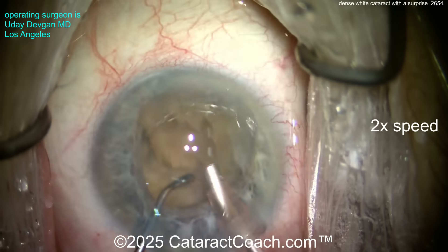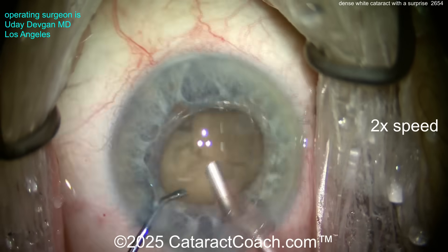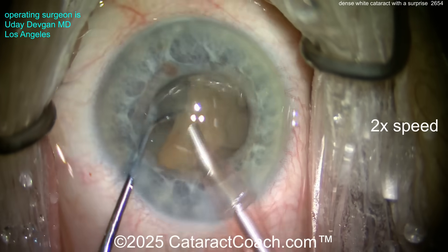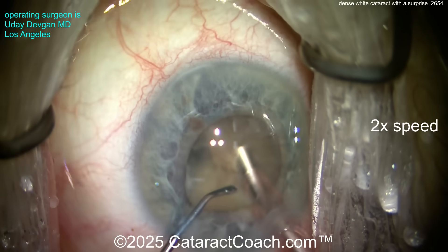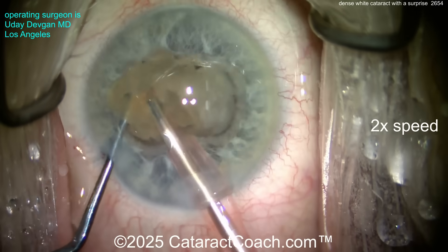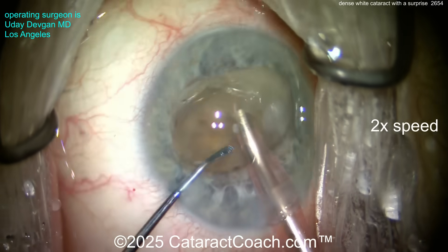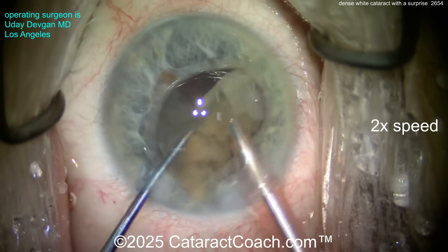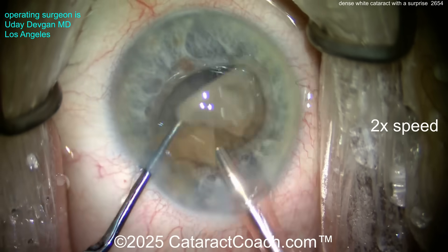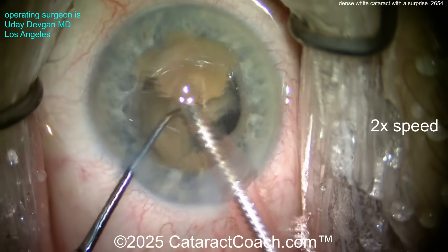The small pupil is actually helpful — we're holding the pupil open with the nucleus. You've got to be very careful not to aspirate or damage the iris. Getting the pieces up nice and easy. I don't want to operate in the posterior segment here; I want to bring these pieces at least partially up — I think it's a safer spot. We couldn't visualize anything preoperatively because of this dense cataract.